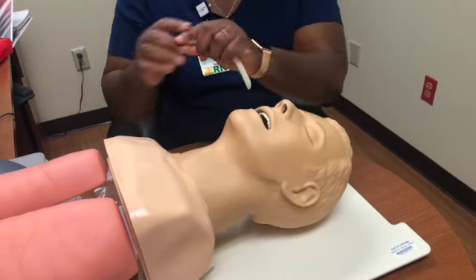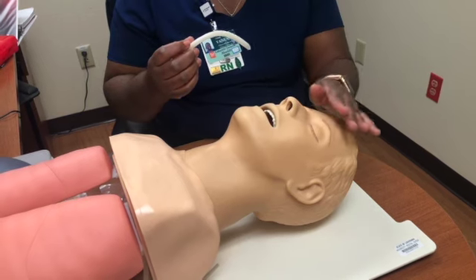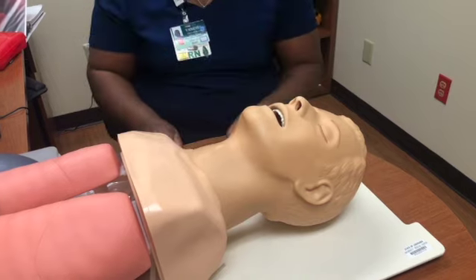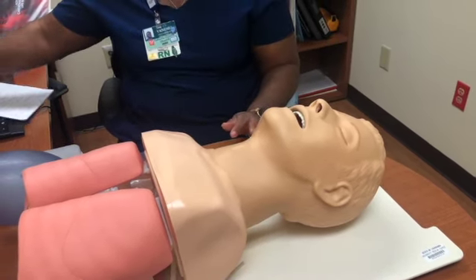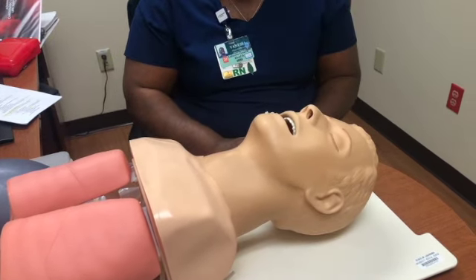And when you're using this airway, of course, if the patient would have any deviated septum or any injuries of that such, you would not use this. There's also a different type if the physician wants to intubate the patient.